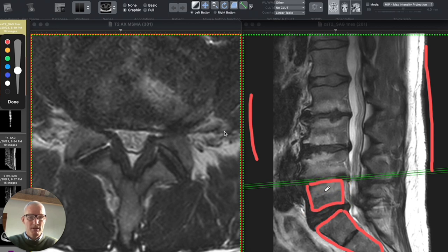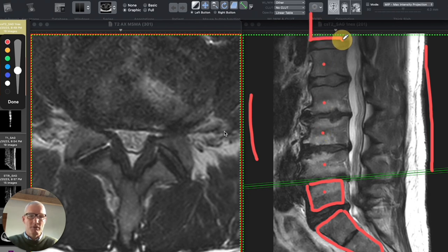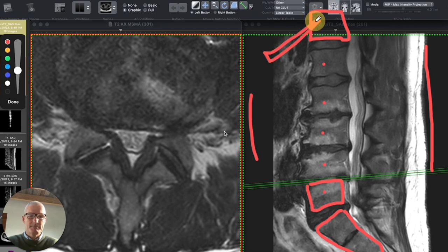So that's the center of L5, L4, L3, L2, L1. And then the 12th thoracic vertebrae would be here, which would have the 12th rib attached to it.